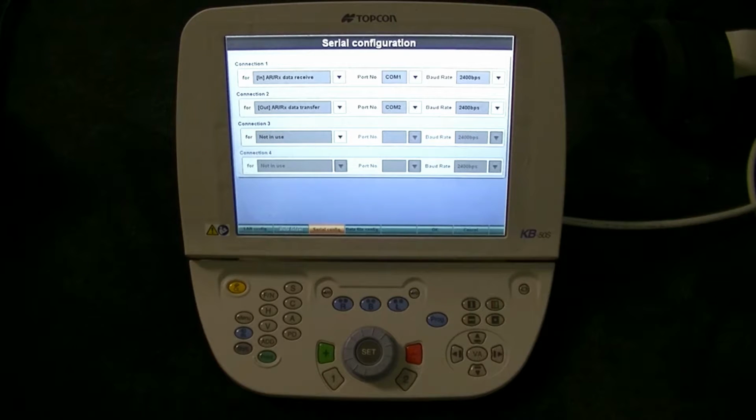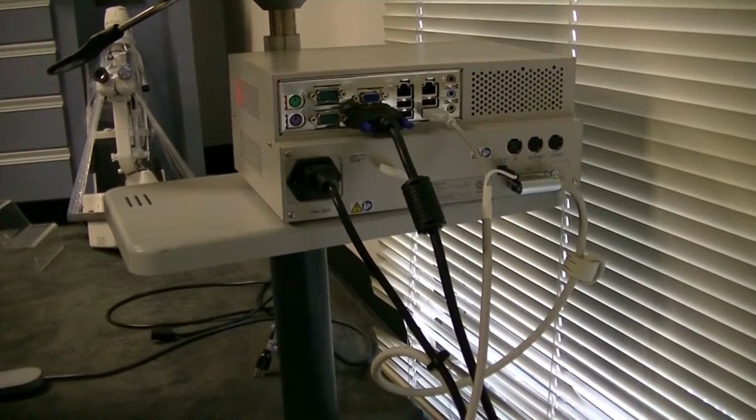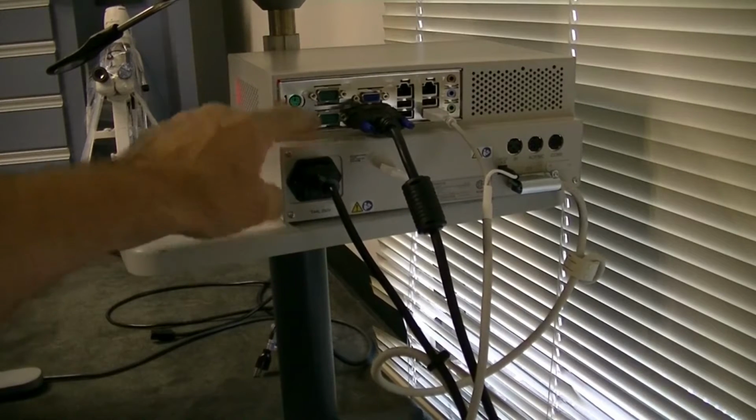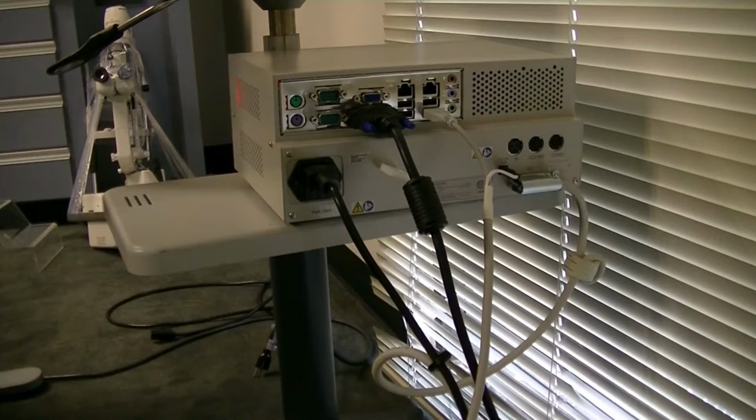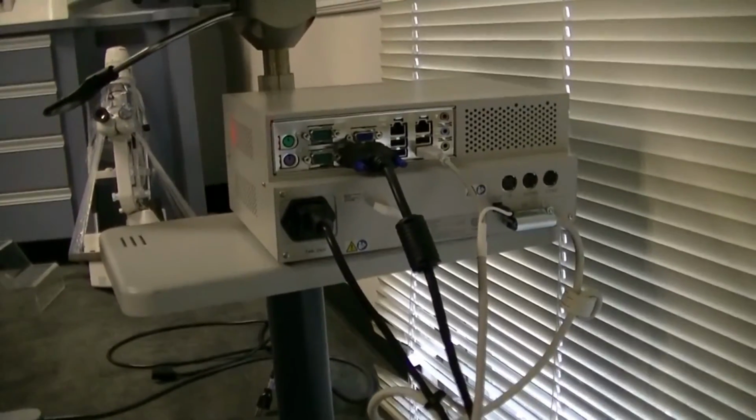And on the back of the power supply, you have different ports. And I'll try to swing over here and show you. So you have different ports, and as you can see right there, this port is COM1, this port is COM2 for the 9-pin serial ports. So you plug the Bluetooth units in there and configure those ports. So the bottom one is configured as port 1 and the top one is configured as port 2. Okay, so that's on the back of the PC-50s. I can maybe zoom in there and we can take a look at that.